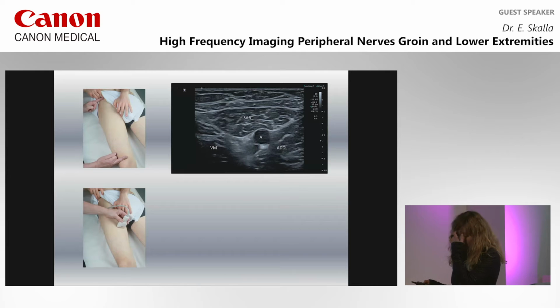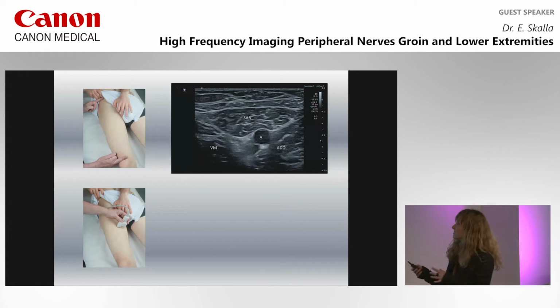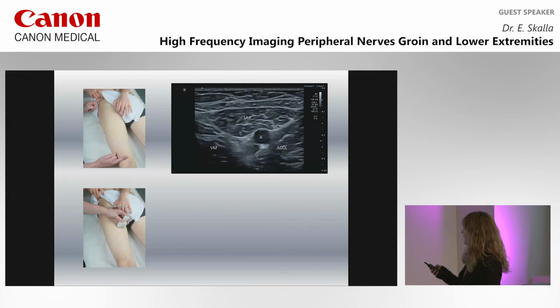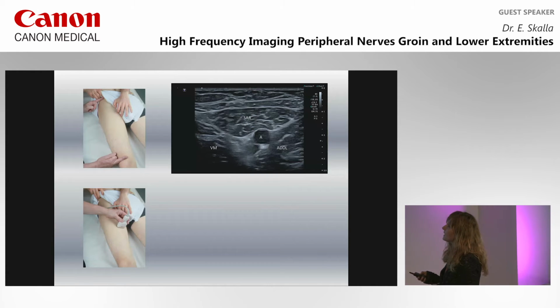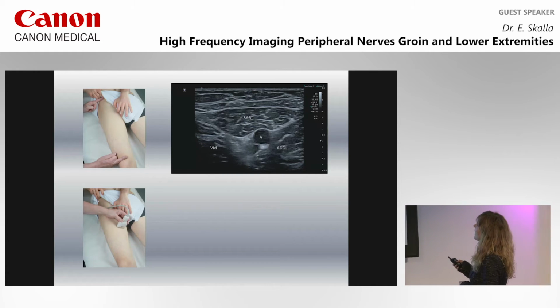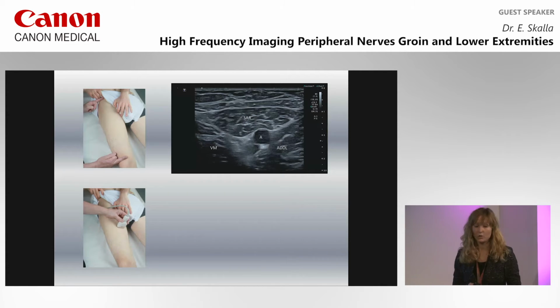And here we see the vessels. They're usually very easy to see, covered by the Sartorius muscle. This muscle usually has a nearly triangular structure here. You can find it very easily. Medial to it, it's the vastus medialis muscle, and here in the deep you can see the adductor longus muscle.